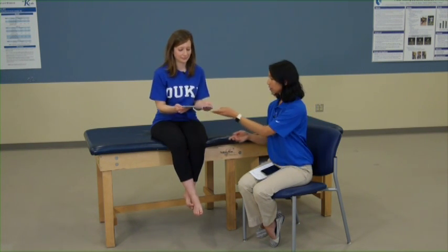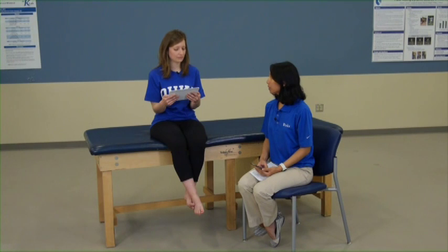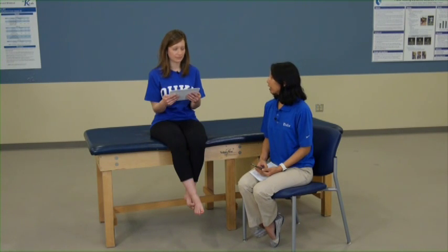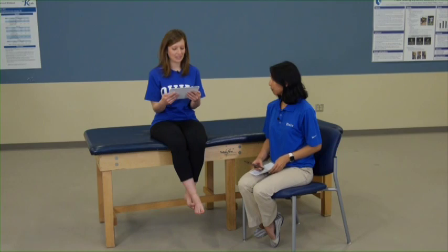I'm going to pass the card on to Leslie. This is a demonstration card. What you're going to do is read from the top to the bottom, left to right, and try to read it as fast as you can. Go ahead and read that card.